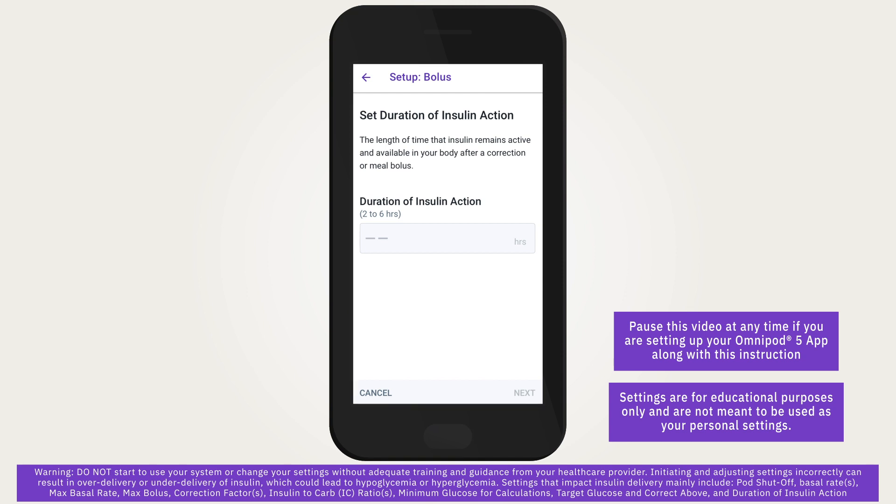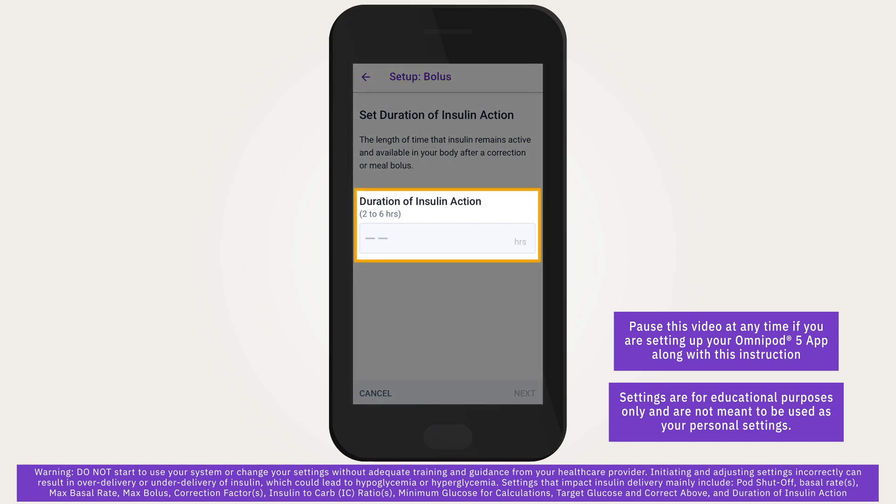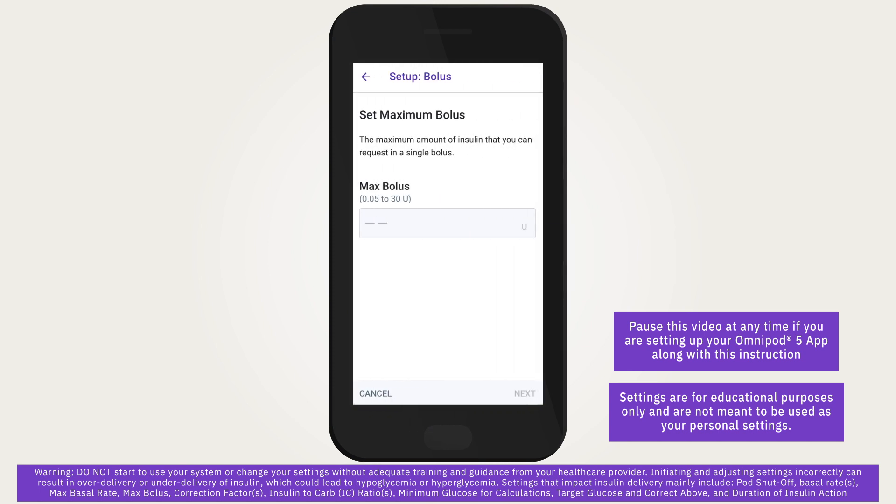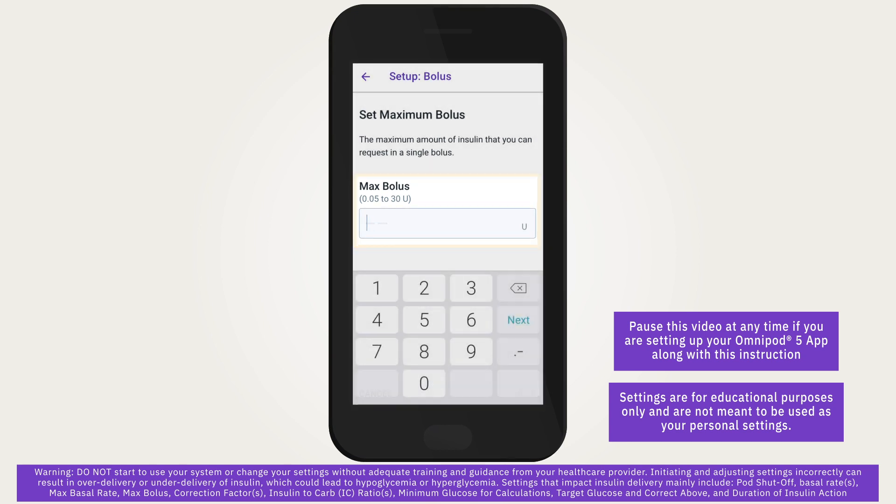Duration of insulin action is the length of time that insulin stays active in the body. The smart bolus calculator uses this setting to determine how much insulin remains in the body from previous boluses, called insulin on board, or IOB for short. Tap the duration of insulin action field and use the scroll wheel to specify the duration. Tap next. Maximum bolus is the upper limit of what the system will allow you to bolus. Tap the max bolus field and use the number pad to specify the maximum bolus amount, then tap next.